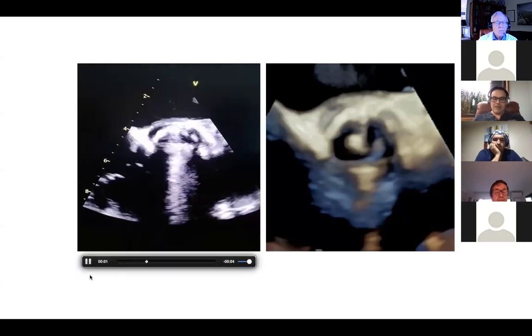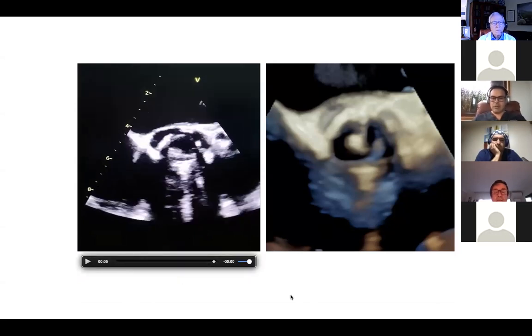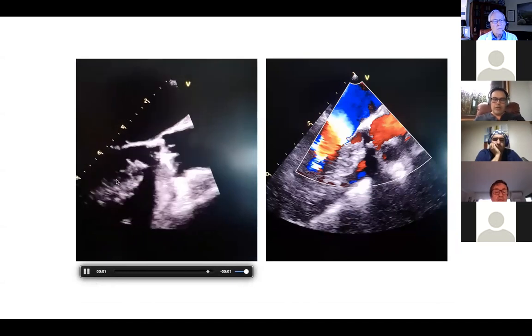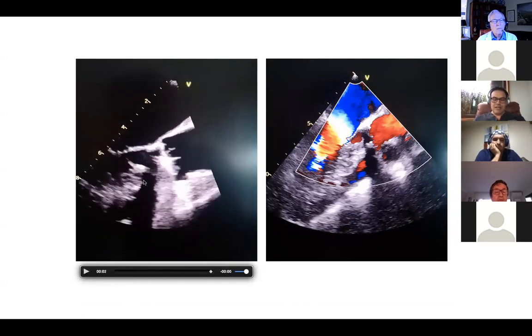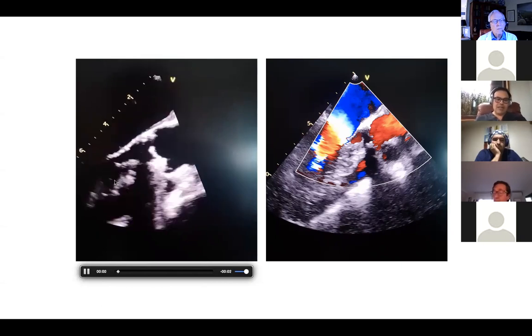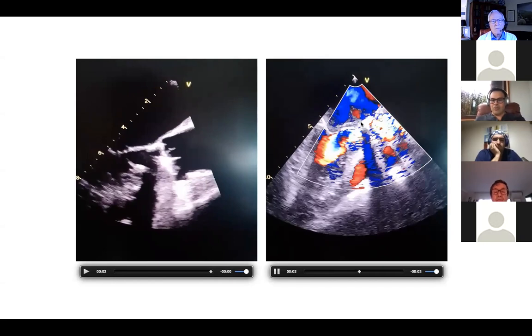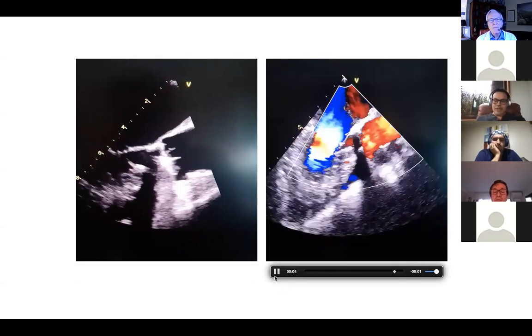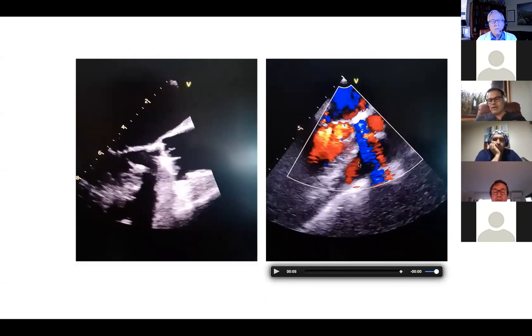The aortic valve seems to move, both discs move quite well, but in this long axis view, let me see. We can also see both discs move nicely, but the LVOT seems to be quite narrow, and the anterior mitral leaflet almost touches the septum. So there's potentially some SAM. Potentially SAM, yeah. And you can see a high speed jet from the subvalvular area to transvalvular.